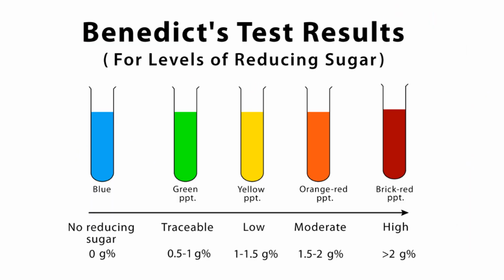Once again, this is showing all the different colors that you can get, which is initially, if it is negative, it is blue, a little more, 0.5 to 1, it is green, then yellow, then orange red, and then brick red. If you ever forget this, you can just remember that these are actually in the order of VIBGYOR. When we quantify light according to their wavelength, the visible light, we call it VIBGYOR, right? So it starts with B and it just follows that pattern, GYO and eventually red, which is R.